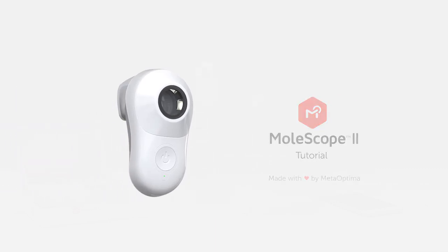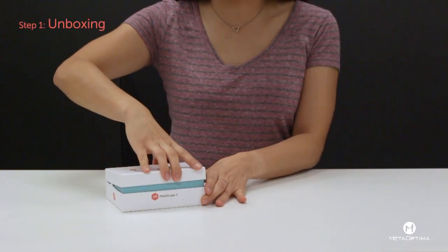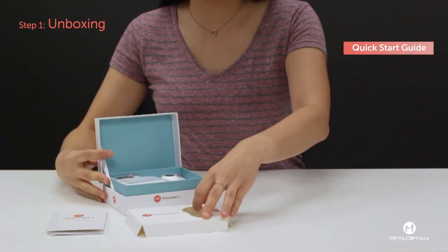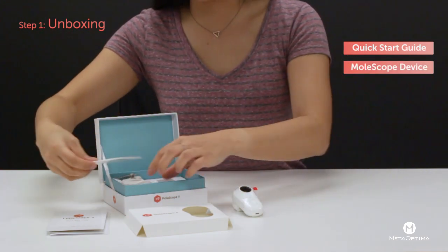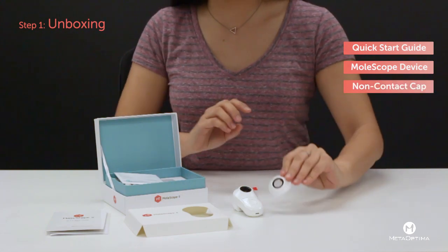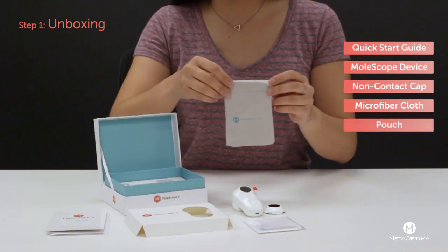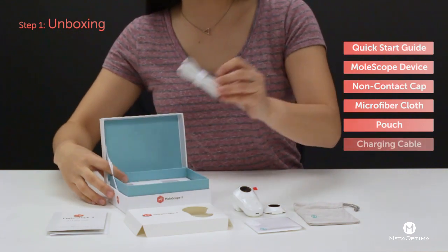Today I'll be showing you how to use your Molescope 2. First, open your Molescope box, where you'll find your quick start guide, Molescope device with contact cap, your non-contact cap, microfiber cloth, pouch, and charging cable.